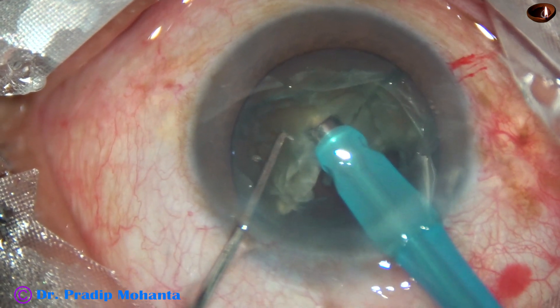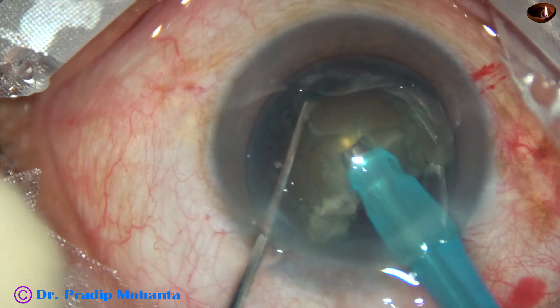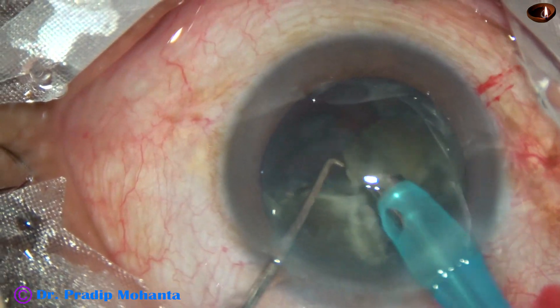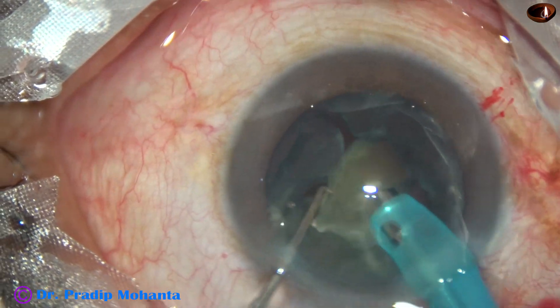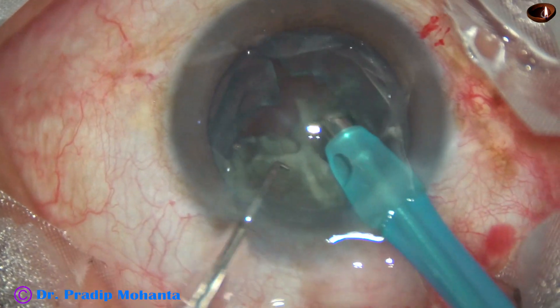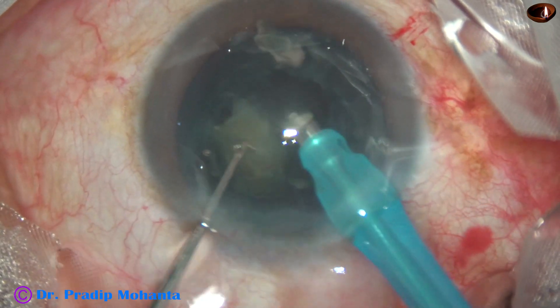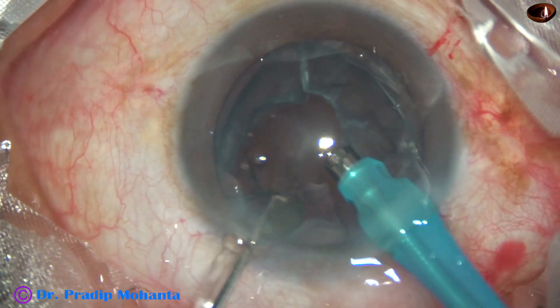This is the other hemi-nucleus. It is also held very firmly and chopped. Always hold the nucleus very firmly, and unless you have held it very firmly, don't try direct chop. Chop only when you have held it very firmly.